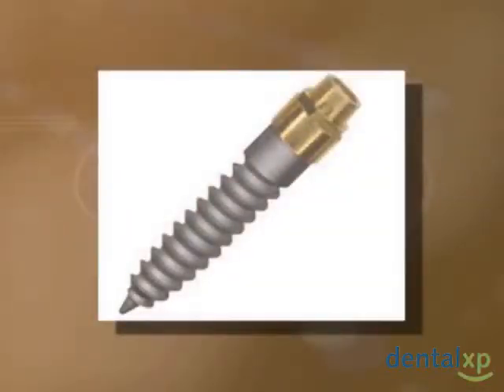This is a 3.25 by 15, and you'll see the etch goes all the way to the base of the abutment. With the countersink, what you're doing basically is preparing the osteotomy to allow this to seat to that level, which is exactly 3.25 millimeters. You want to seat the silver portion, or the etched portion, into bone and keep the gold portion, or the cuff height, above bone, right? And this is 1 millimeter base from the silver portion, or the etched portion, to the top of the hex there.